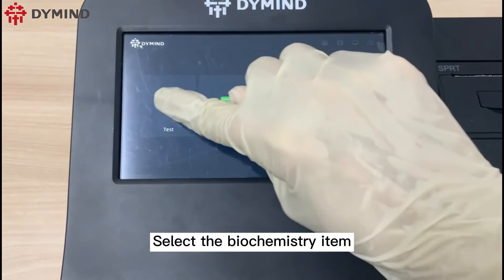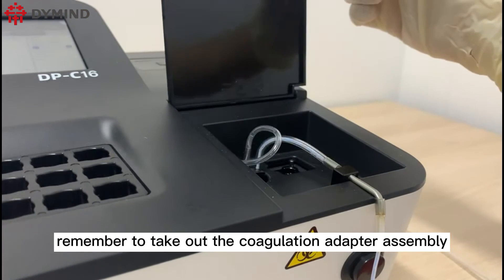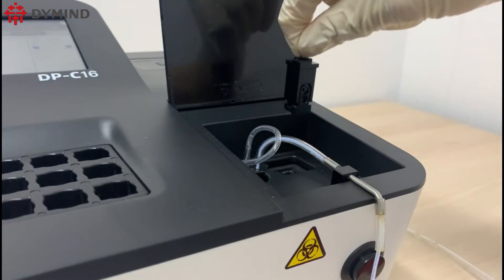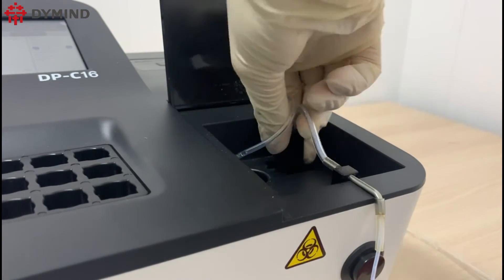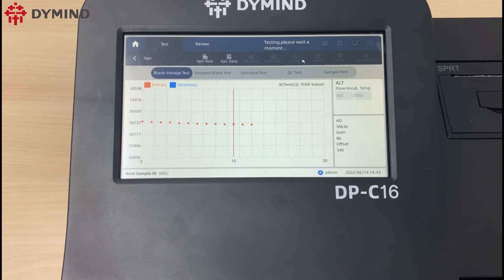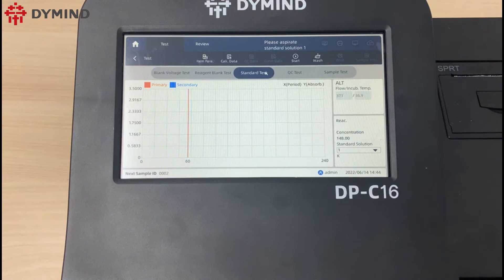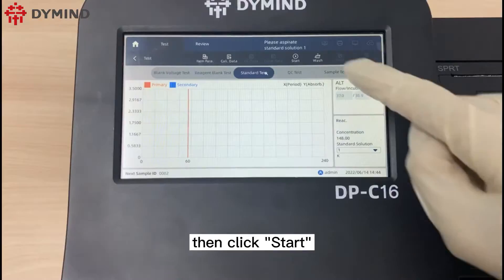Select the biochemistry item. Please remember to take out the coagulation adapter assembly and install the biochemistry flow cell chamber. Use the sample tube to aspirate the pure water, then click start. Click standard test to make a calibration. Please use the sample tube to aspirate the calibrator, then click start.